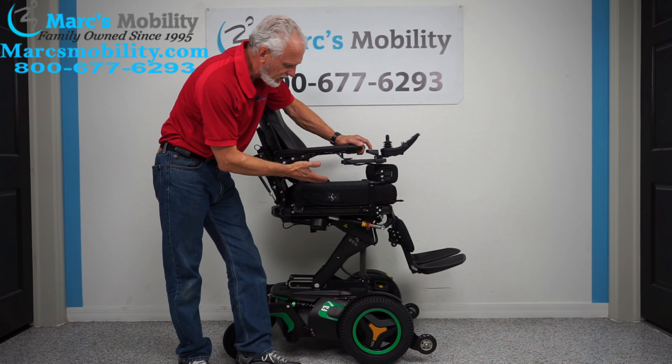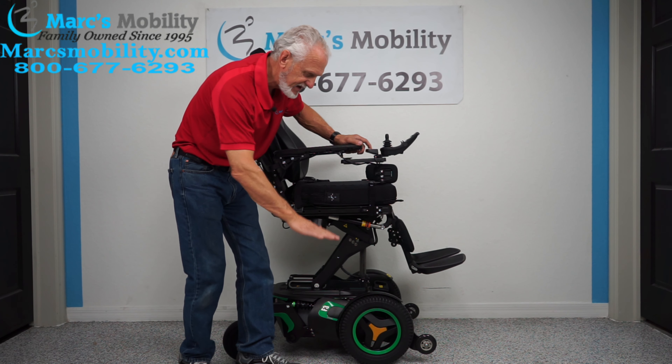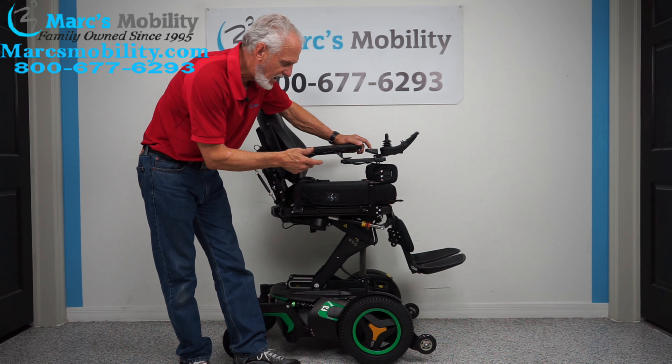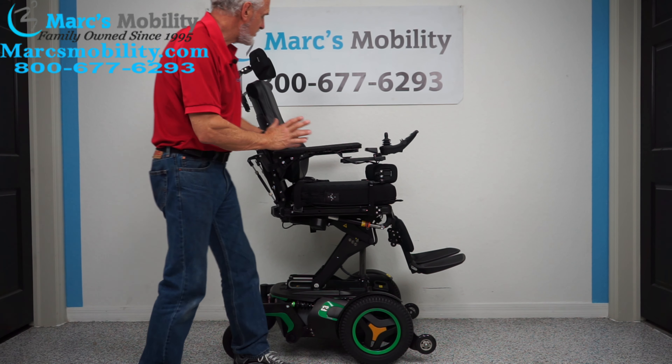The nice thing about this chair is it helps you get out of the chair, which I'll show you later — how to get out with the seat elevated a little bit. So if you have trouble getting out and pushing out and doing all that, I'll show you how easy it is with this chair in a few minutes.